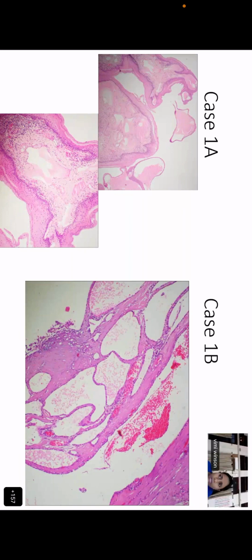Secretion is what one cell is secreting, but it should not be included in a histopathology description. Secretions are not to be included in a histopathology description. We will be saying it is a pale eosinophilic or a basophilic material. We can't say secretion.